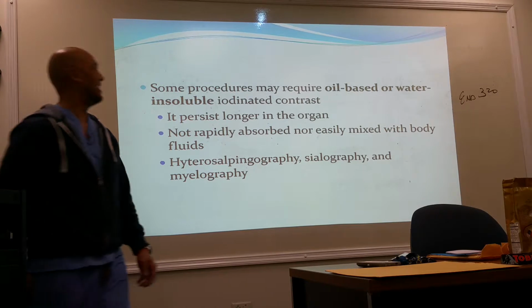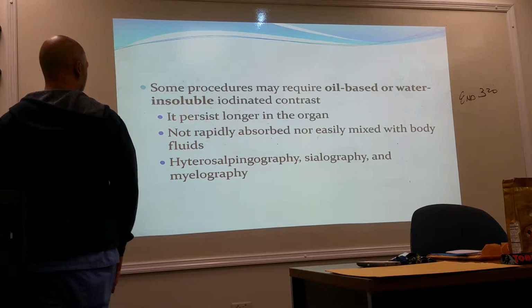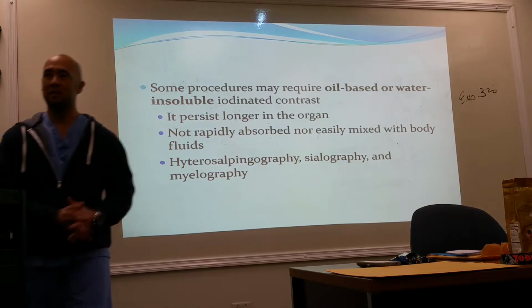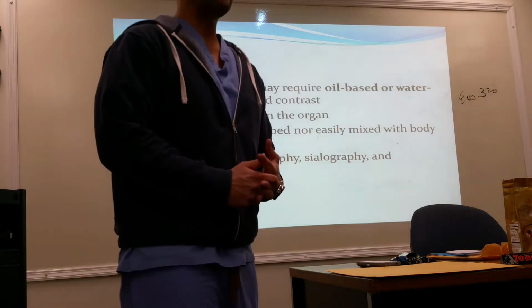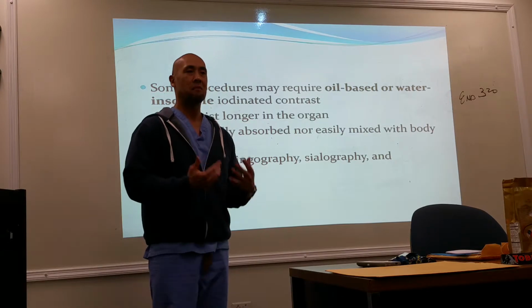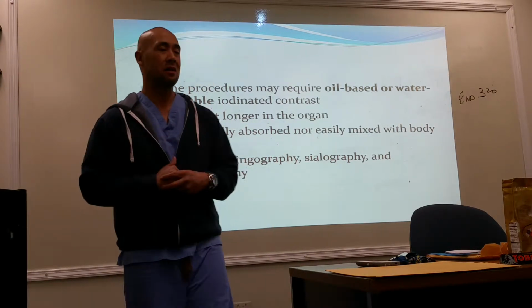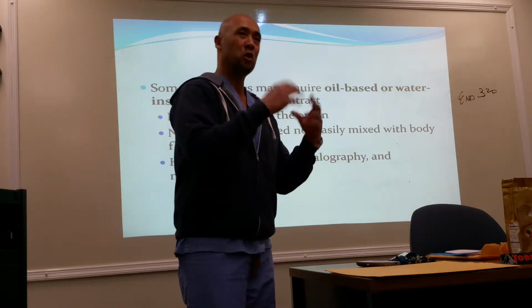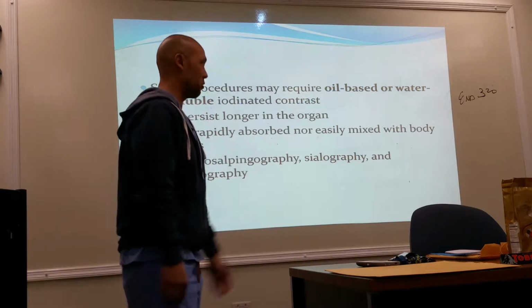Okay, some procedures may require oil-based or water-insoluble iodinated contrast. The problem with that is that it does persist a little bit longer in the organs, so it's not easily absorbable. In the olden days, they did do procedures using oil-based contrast, especially in myelograms. So let's just say somebody had a myelogram, we use oil-based contrast. Three or four months later, we're doing another myelogram, and the contrast is still there. So it doesn't get absorbed that quickly.